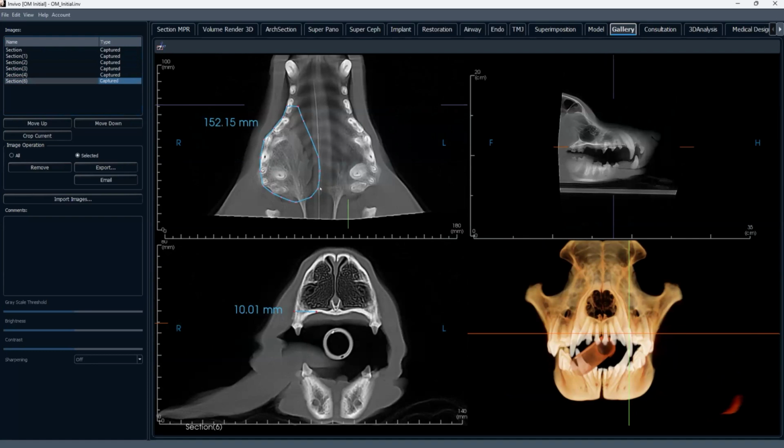And you can apply all this, put it in the gallery, save it as a JPEG, put it in a folder, and then you can flip through these images chairside. And so we had done all this before the day of surgery on the original scan, but then 5 weeks went by. So we actually went and did it again on the day of surgery just to deal with any progression.